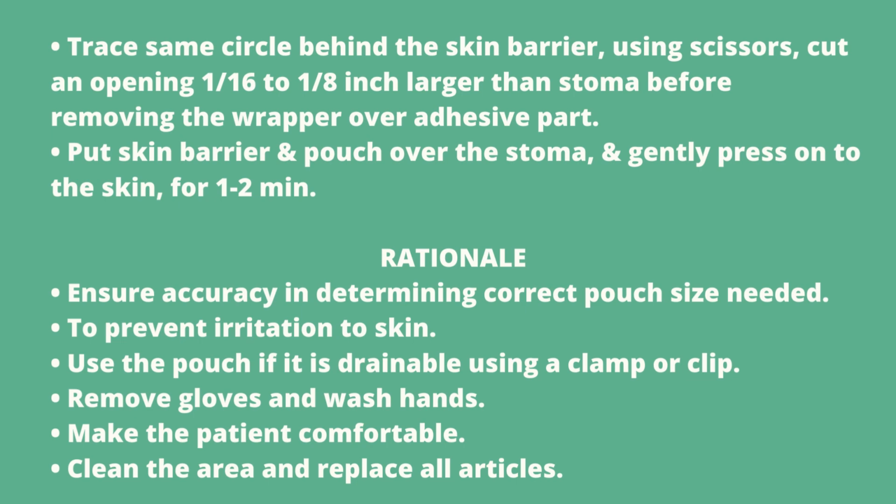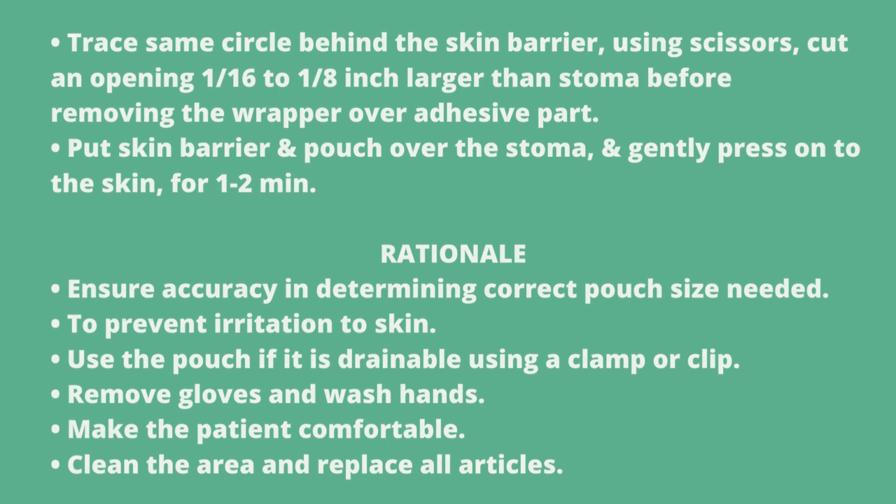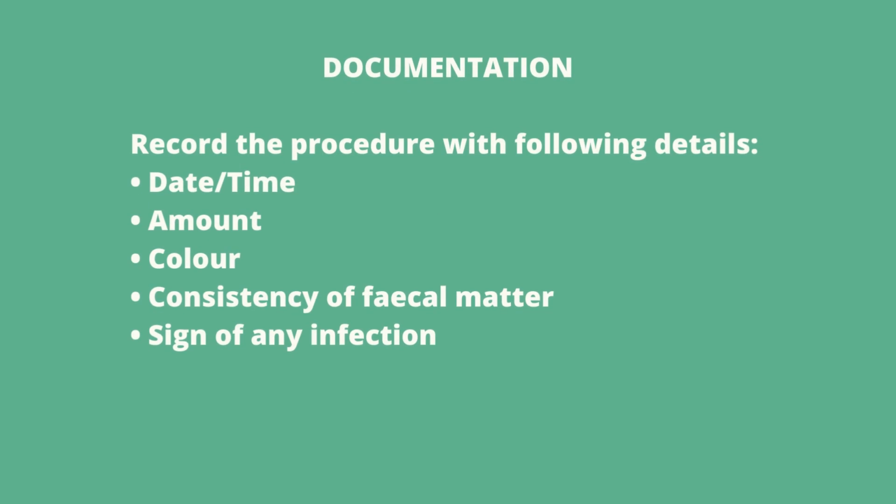Remove gloves and wash your hands carefully. Make the patient comfortable. That is also important. After all those procedures, we need to make the patient comfortable. Okay, clean the area and replace all articles. That is also important for all nurses.